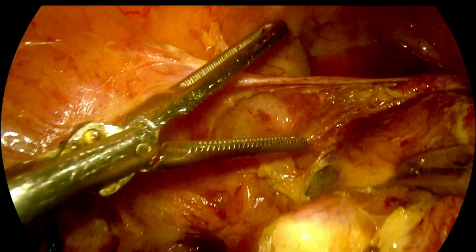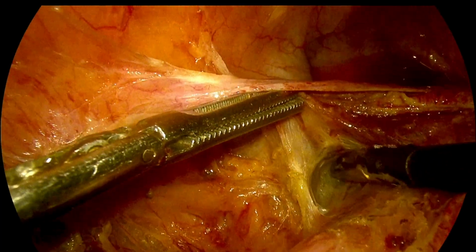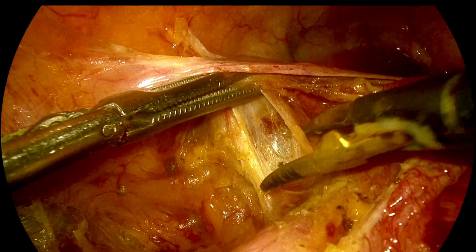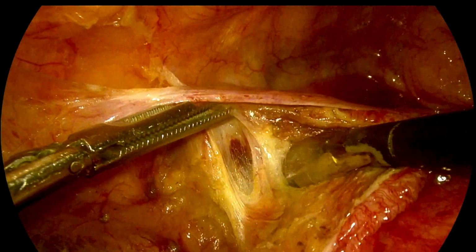Here in this patient, there is a doubled-up folding of the bladder onto the anterior wall of the uterus. The superior surface is also folded back onto the body of the uterus, and the base of the bladder is always there, attaching to the lower part of the cervix and upper part of the vagina.